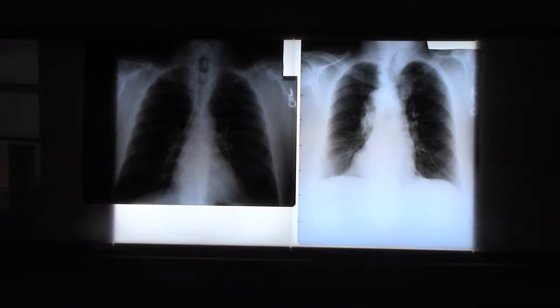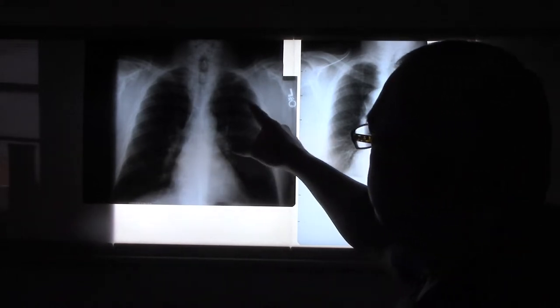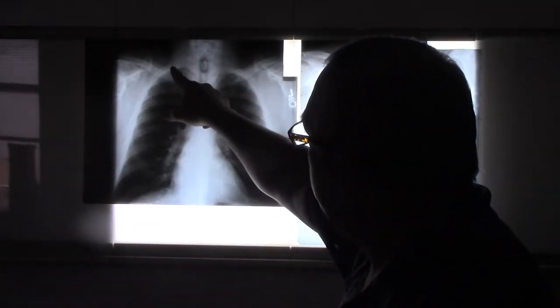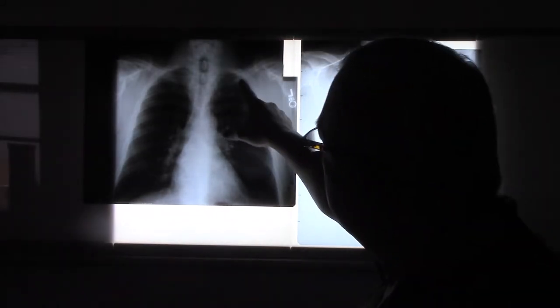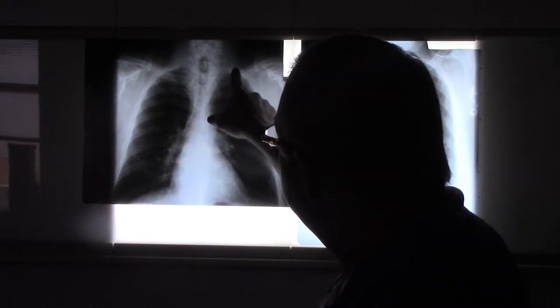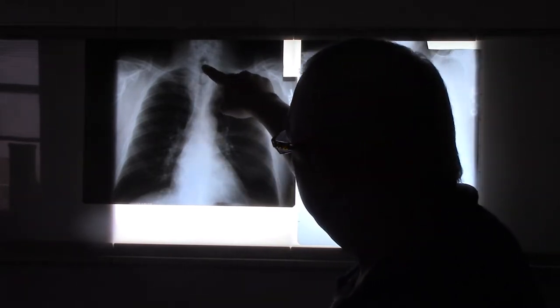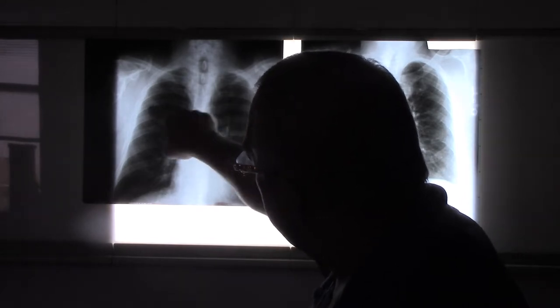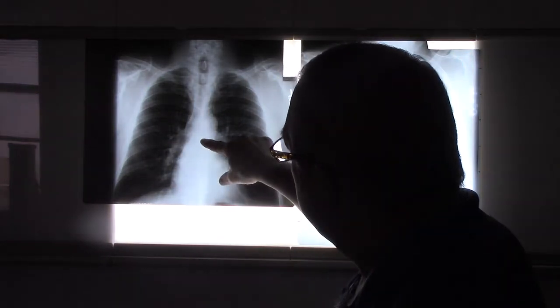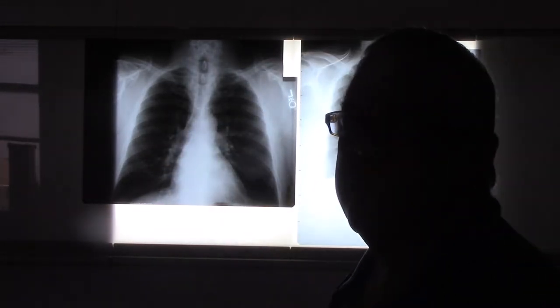Alright. I know this is some old-school flat film-looking stuff, so please keep the laughter to a minimum. How do you find T1 on a chest X-ray? It's not that hard — the first rib has a really weird C or hook shape that's very pronounced, so you can generally find it right up at the apices. Find that first rib, follow it back to where it articulates with T1. So here goes T1, 2, 3, 4, 5, 6, 7. Here's T7. Where's the inferior angle of the scapula? It's here between T7 and T8. We could have gone to the angle and gone up a little bit, and we would have had a better centering for our X-ray.